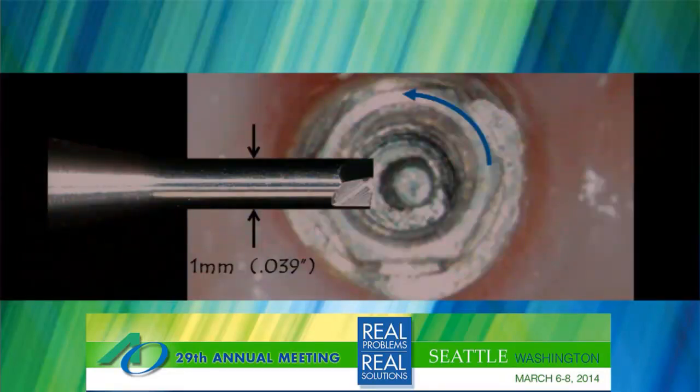Now, normally, I don't have to drill that deep, and here's the technique. I initiate the drill into the screw fragment. Remember, this is a very locked fragment. It won't come out with just routine issues. So I go down about half a millimeter, about 20 thousandths of an inch, and then, utilizing by hand this fragment fork, a 1 millimeter fragment fork, which is 39 thousandths of an inch.